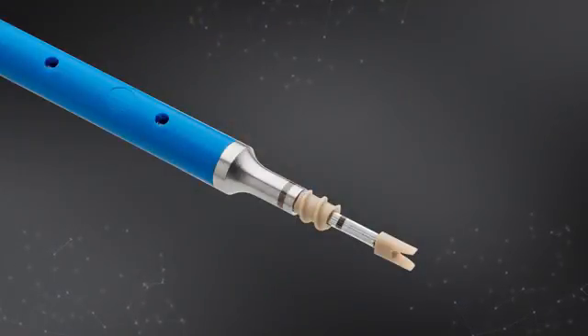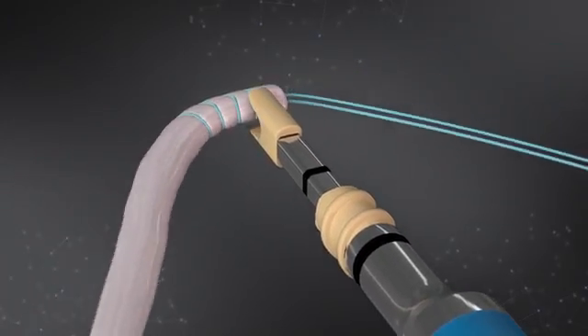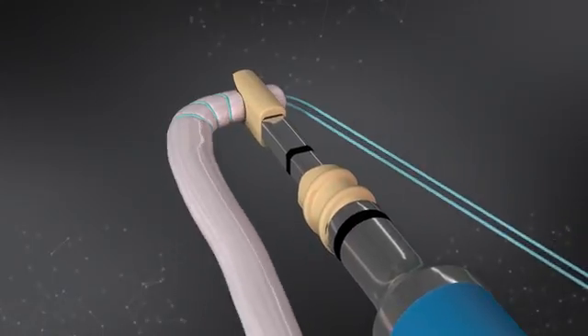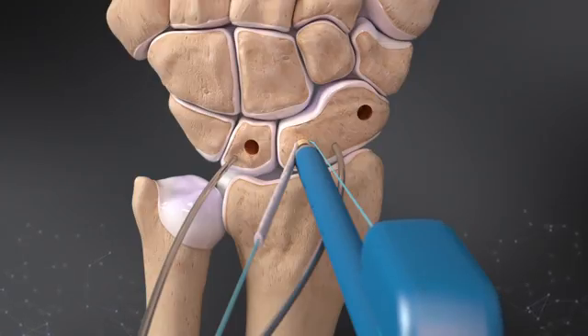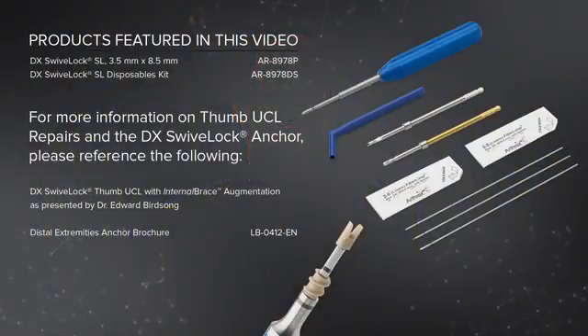As you can see in this picture here, the swivel lock anchor consists of a fork tip and anchor body. The fork tip allows the surgeon to capture a tendon graft and suture and place that into the drill hole prior to inserting the anchor body into the bone. This construct allows for both biology and a synthetic construct to cross the joint.